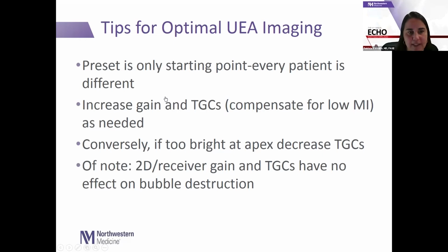Remember that the preset is only a starting point. Every patient is different. You can adjust the gain and TGCs if needed. If the apex is too bright, remember to decrease TGCs. And remember that 2D receiver gain and TGCs have no effect on bubble destruction.